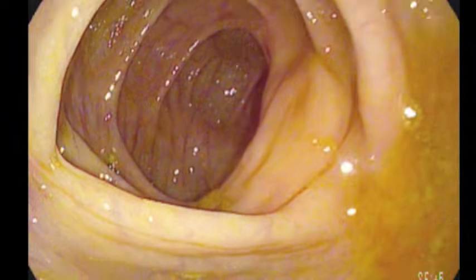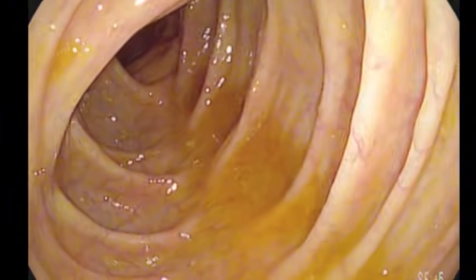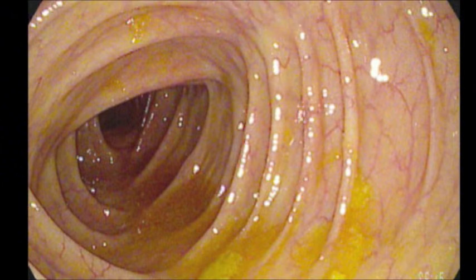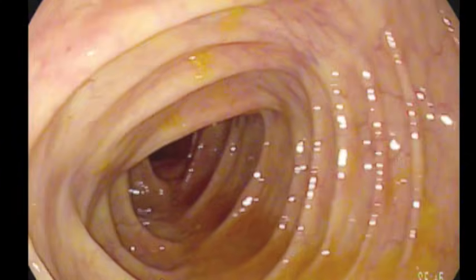The large intestine functions primarily to absorb fluids and gases, along with vitamin K. It also produces abundant mucus, which lubricates its lining and facilitates the passage of fecal matter. Here, the repeating pattern of pouches and folds can be seen. The pouches are referred to as haustra, while the folds are referred to as plicae semilunares. Also notice the colonic mucosa is almost completely transparent, allowing the viewer to see the extensive network of vasculature that nurtures these tissues.